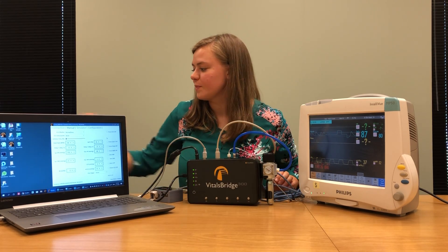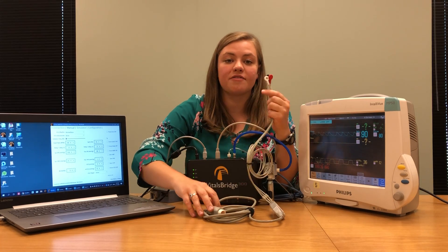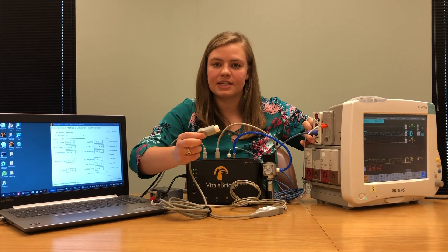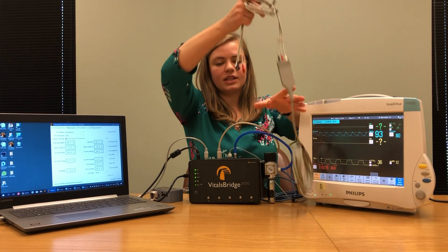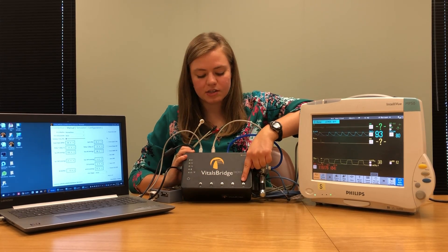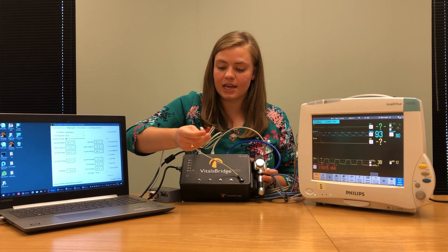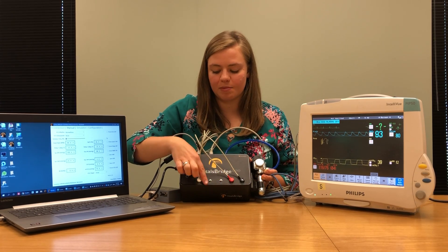The next thing we're going to connect is our ECG cable. For this demonstration I'm using a three-lead ECG cable, though you might have a five-lead or four-lead cable — whatever you have should work fine. Take the end of the ECG cable that plugs into the patient monitor and find where it says ECG on the side of your patient monitor. Plug the cable in, then take the ECG leads on the other end and attach them to the buttons on the bottom of your VitalsBridge. These buttons have little colored stripes underneath each one. The colors on your leads should match the colors underneath each button — black, red, and white. If you have additional leads, plug them in following the color patterns.